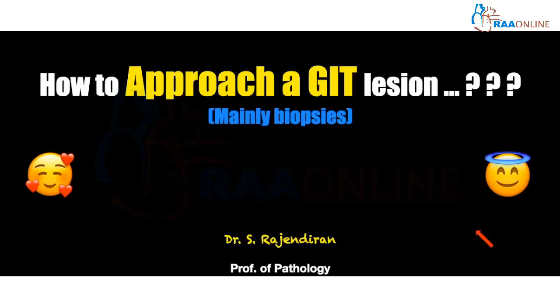This time I thought I will just go through the basic points in the GIT lesion, how to approach. Predominantly, it covers GIT biopsies. Again, it's more morphology based. I may not be talking much of molecular.